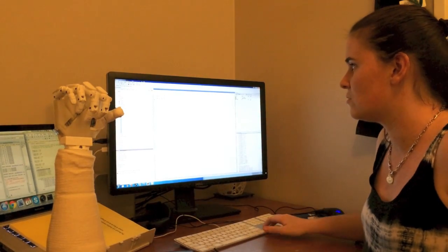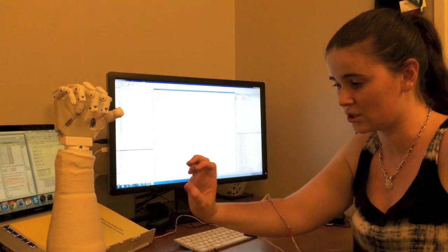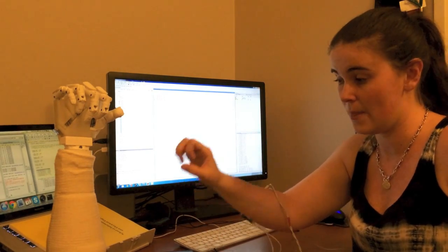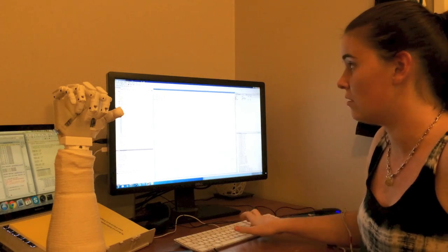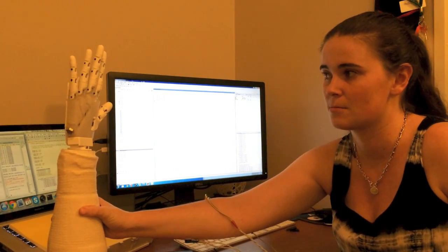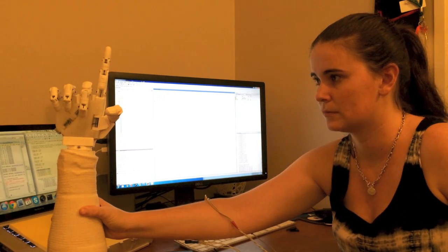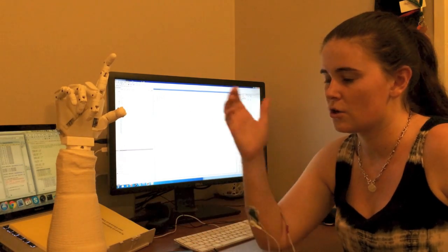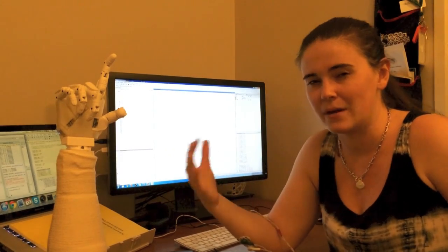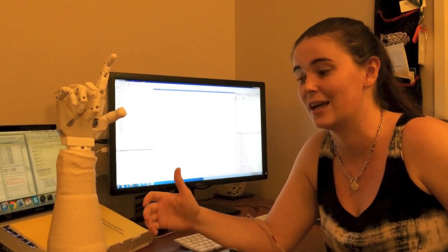So instead of doing a fist, I can now make it point using the same signals of flexion and extension and then making a fist. But now I'll map it to a different pattern and it will point instead of making a fist. So what you see there, this mapping of different gestures, is actually how current commercially available prosthetic hands work.